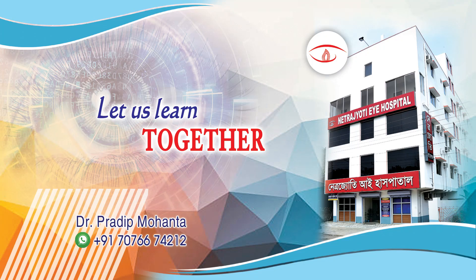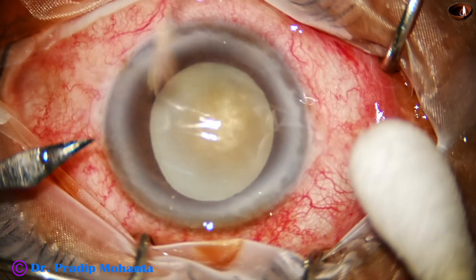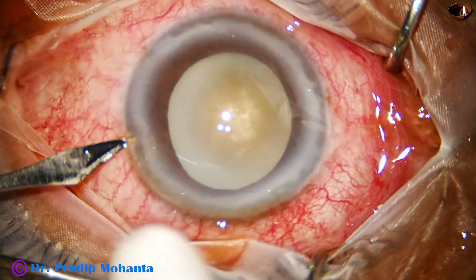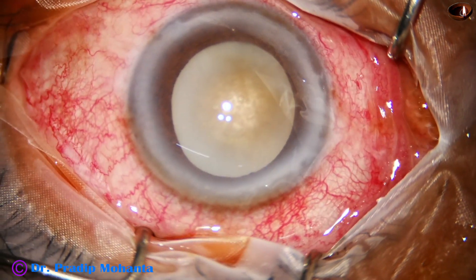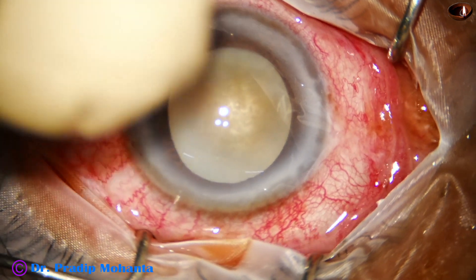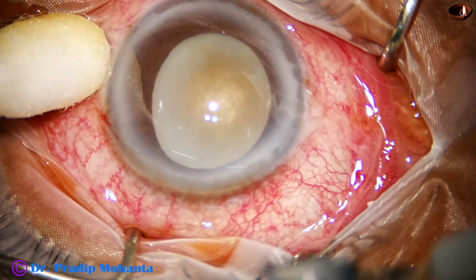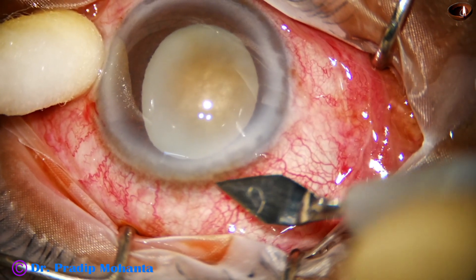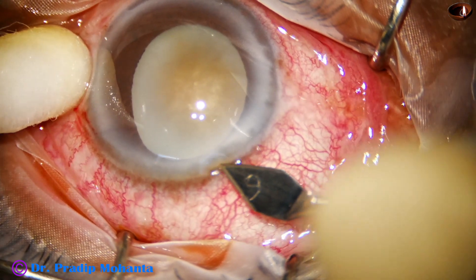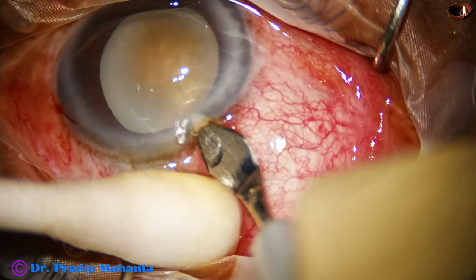Welcome to this workplace for hands-on phaco and SICS training. This is a totally unedited surgery — a case of hypermature morgagnian cataract with phacolytic glaucoma. The intraocular pressure was 64 mmHg; with anti-glaucoma medications the pressure came down to 40 mmHg, and the case has been taken for surgery.